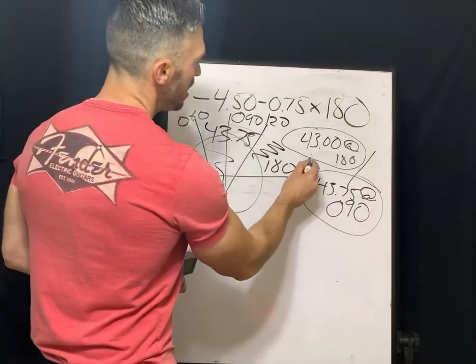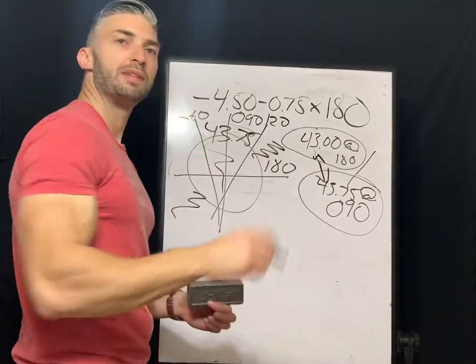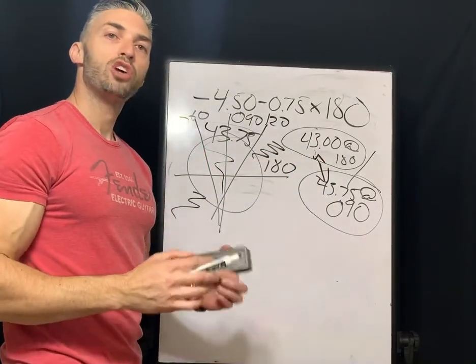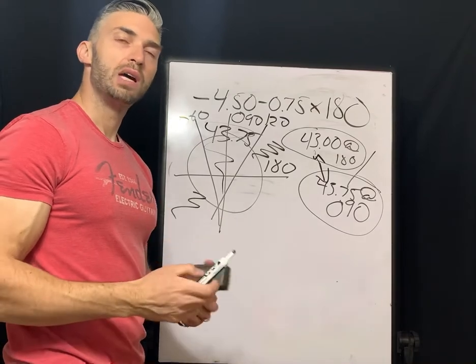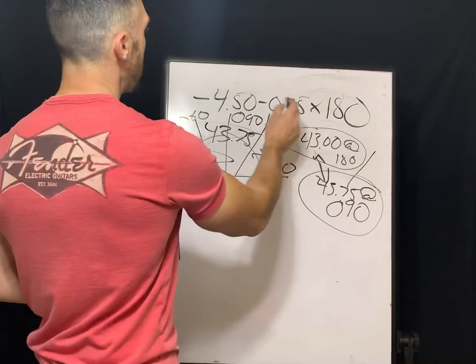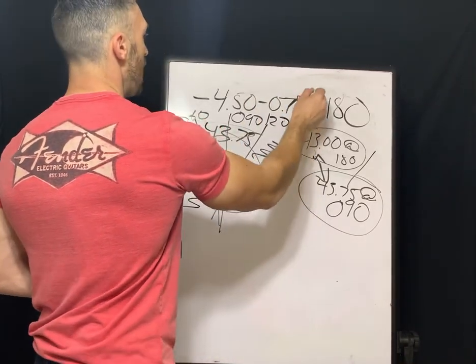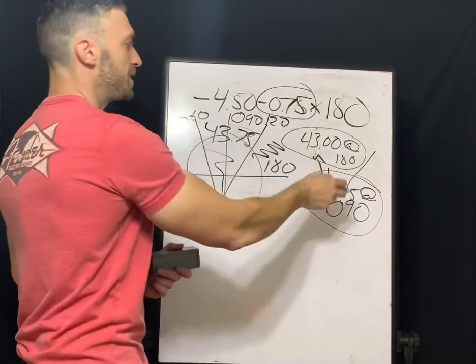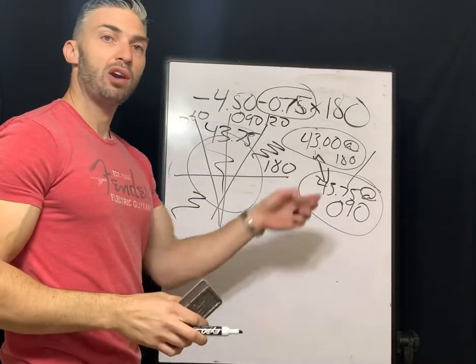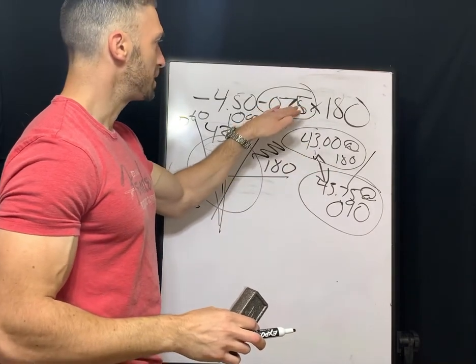So what we see here, and what I was getting to before I took a rabbit trail, was that there's 0.75 diopters difference between our steepest and flattest meridians. And what that's showing you is the corneal astigmatism, because the keratometer is measuring corneal astigmatism. And we compare that with our refracted overall astigmatism, and we see it has the same amount of astigmatism.